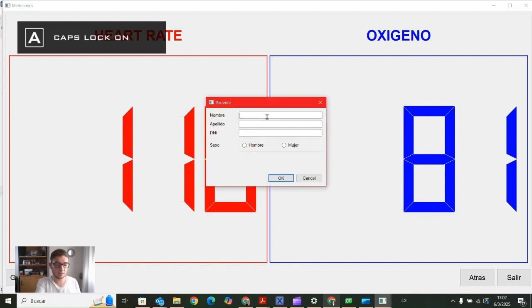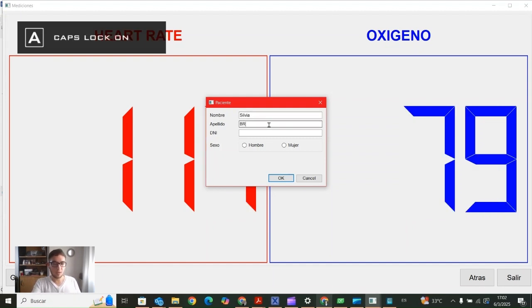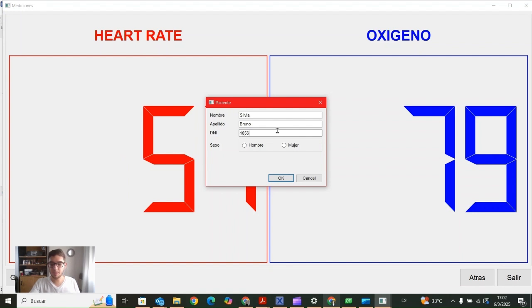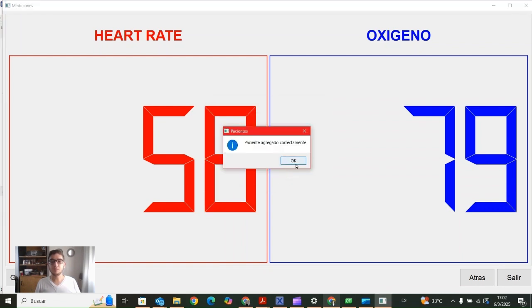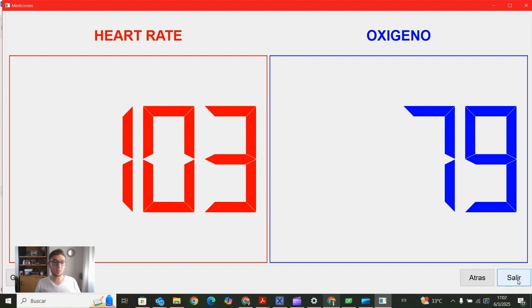Maybe someone else, my mother, for example. At this moment, I'm moving the finger a little bit, so measurements are changing a little bit. Okay. When you click on atrás, that would be like go back, and salir, that would be exit. It's going to exit anyway. So we should click any of these two, and we are going to exit the program momentaneously.